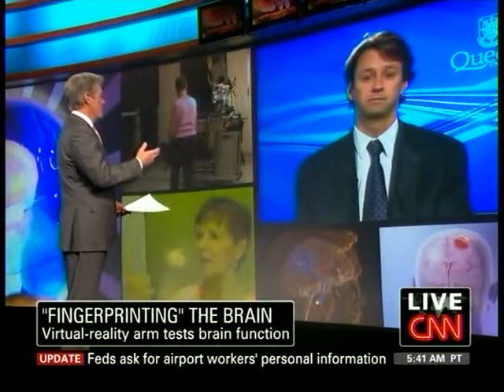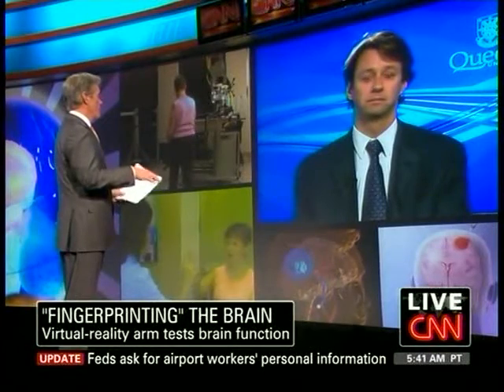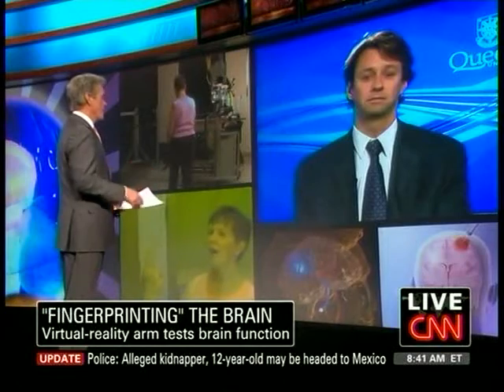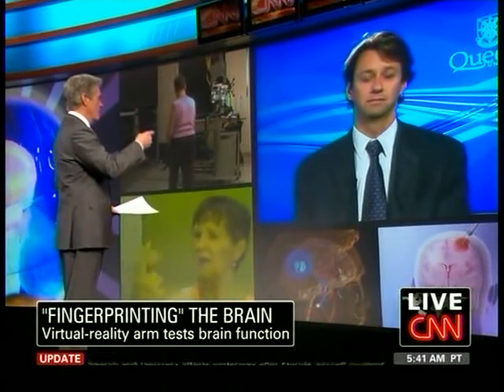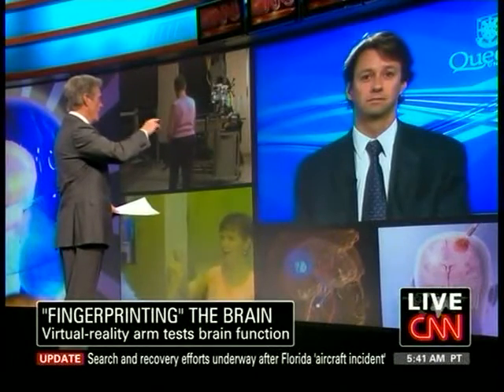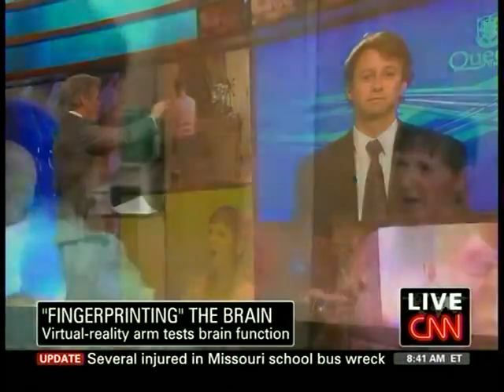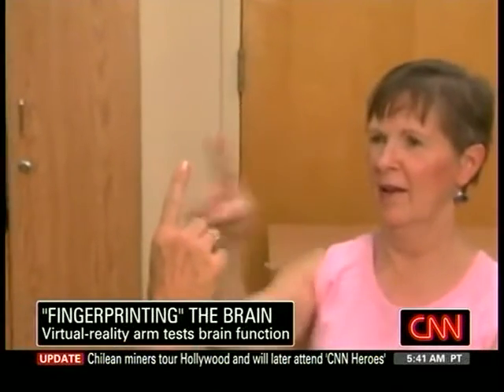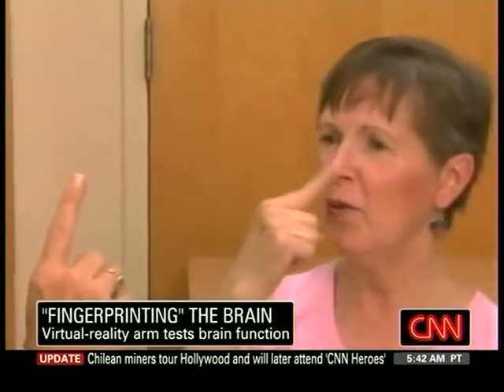Now, you've come up with a machine that uses computer programs and virtual reality to try to tell if somebody has got a lack of brain function because of an injury. Let's roll some video, first of all, of current techniques. A neurologist will sit in front of a patient, hold their finger out, ask the patient to put the finger on the doctor's finger, then touch their nose. Now let's take a look at your technology, which sits people inside this machine.